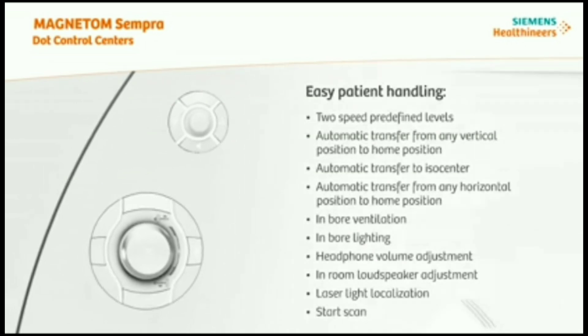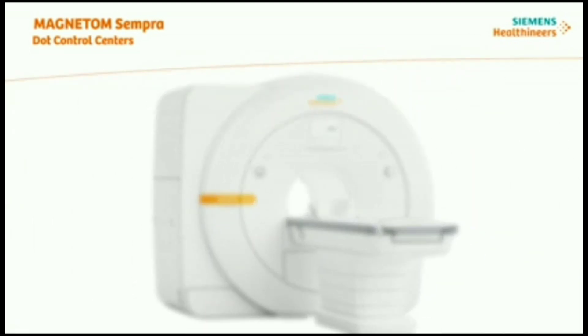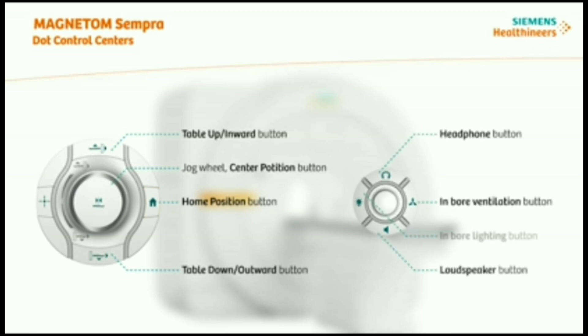The DOT control center consists of two control units, each with a jog wheel and several additional buttons for easy patient handling, like positioning the table. To operate the patient table safely and efficiently, you must be familiar with its most important positions, including the home position button. This control unit is also for menu navigation at the DOT display and for adjusting settings for patient comfort like headphones, in-bore ventilation, loudspeaker, and in-bore lighting.